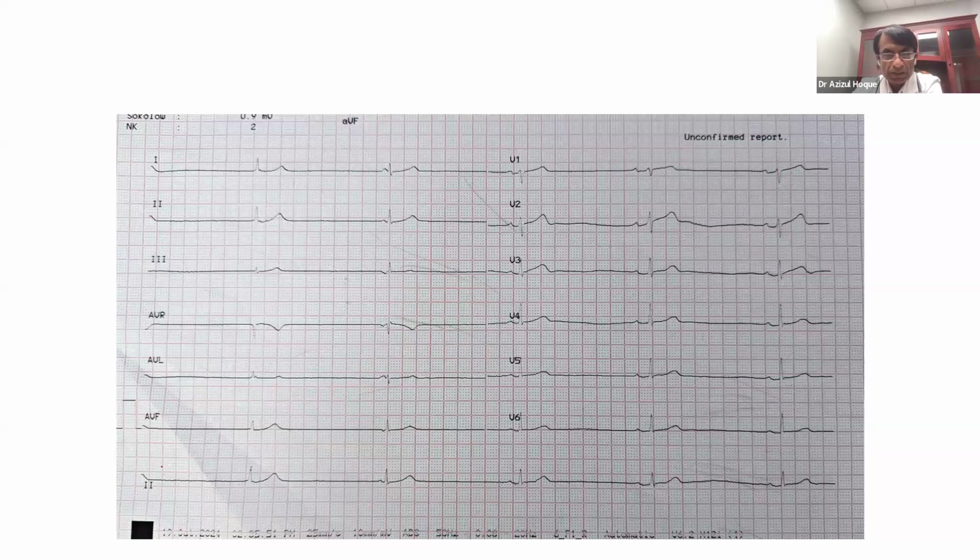But I do agree with that. There's baseline sinus bradycardia. Looking at the atrial rate, they're marching together. Yes, there's a dissociation there, but sinus bradycardia can be by itself, and AV dissociation could be by itself. That is true. But sometimes we see isorhythmic rhythm, but at that time the sinus rate and ventricular rate are pretty much similar, but they have dissociation. But here the ventricular rate is probably a little bit lower than the sinus rate, but you have to march it to see that.